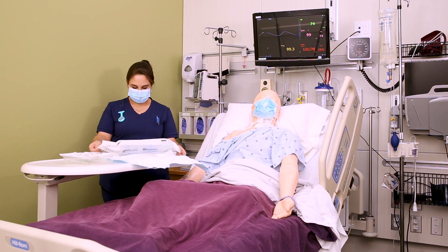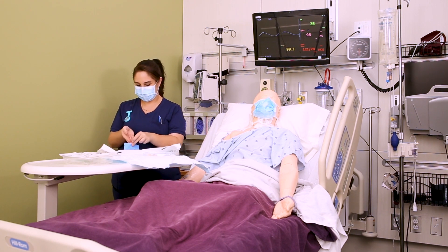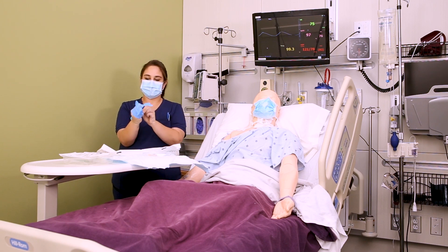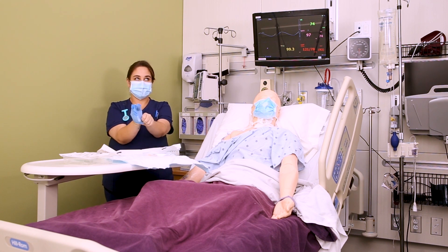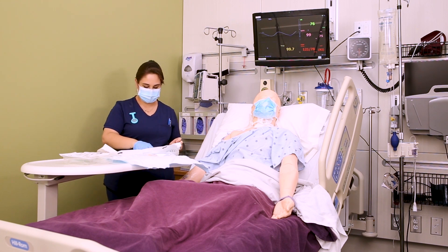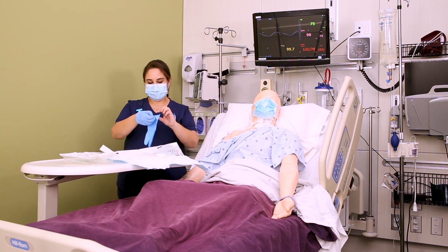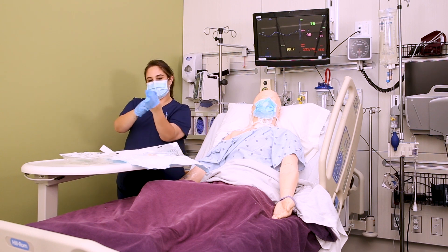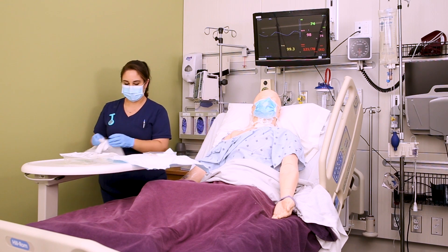Put on your sterile gloves. If you need a review on sterile gloving, there's a whole video lesson available — it just takes practice. Once both sterile gloves are on, remember you can touch anything that's sterile, including the inside of the package. Go ahead and throw away the packaging.